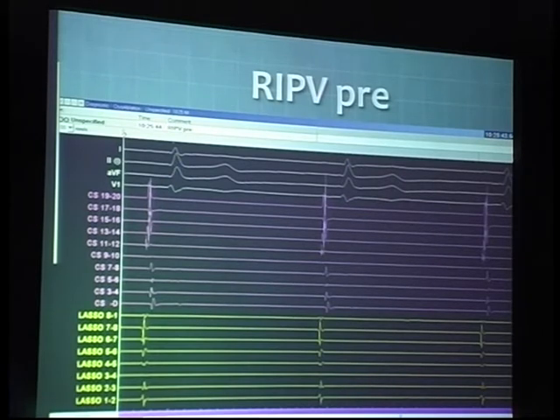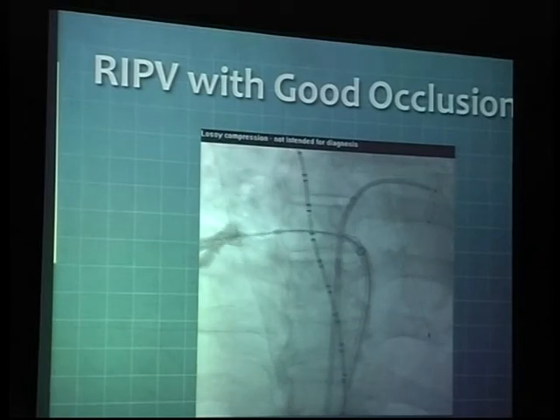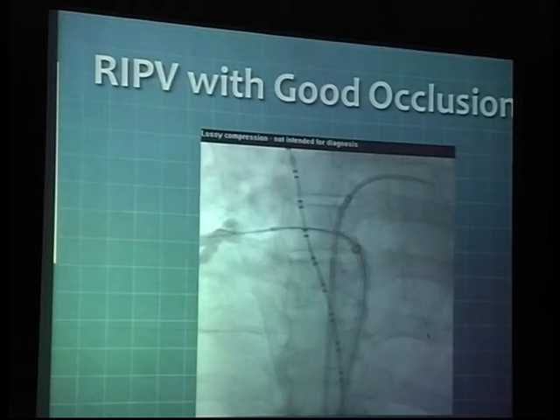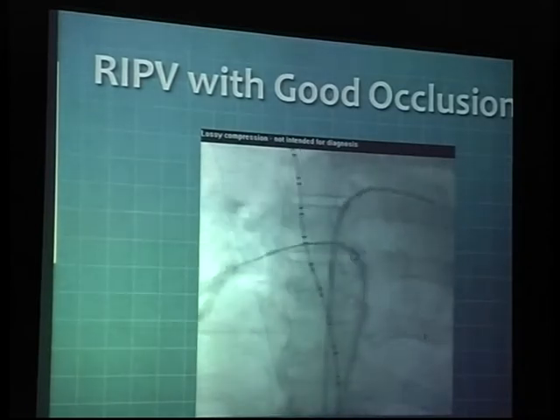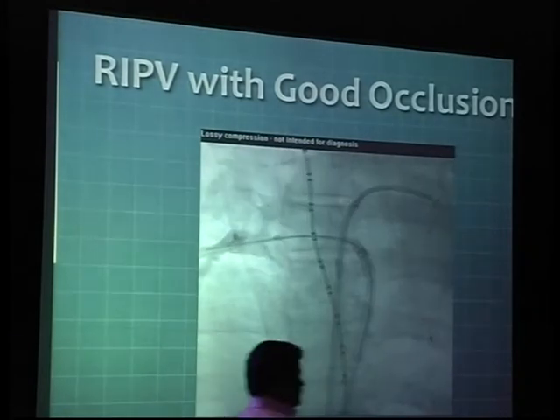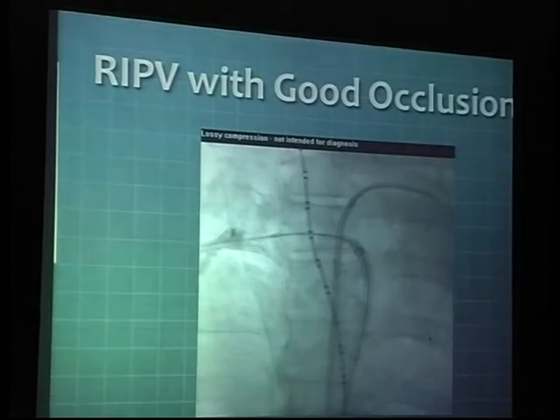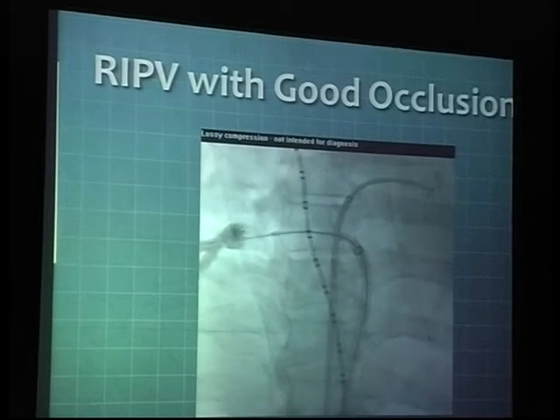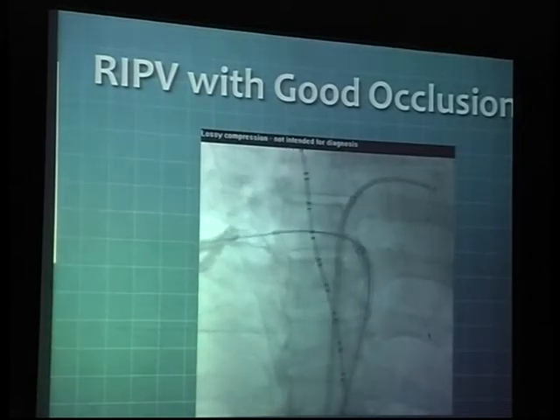This is the right inferior pulmonary vein before isolation, and you definitely see double potential in there. This is where we have the RIPV occlusion. What you see is slow intermittent stimulation of the diaphragmatic nerve with a catheter placed at the SVC. This is one area that is very important when ablating the right-sided veins, more so with the right superior pulmonary vein. You would want to pace the phrenic nerve to appreciate the excursion of the diaphragm. You don't really have to pace it very fast — it can be pretty slow. When you come on the cryo-application and the moment you see the diaphragmatic excursion slowing down, you really want to thaw out and change the position of your ablation catheter, then reapply and be able to isolate the vein.